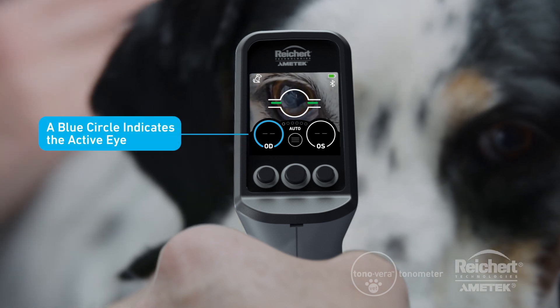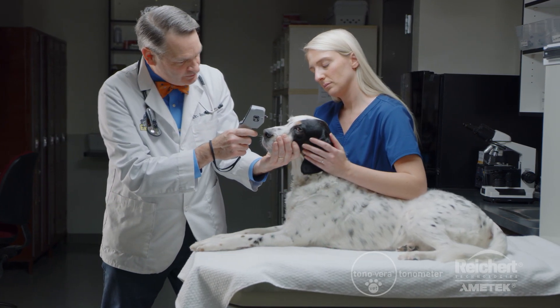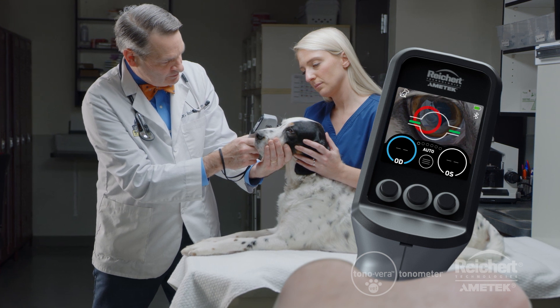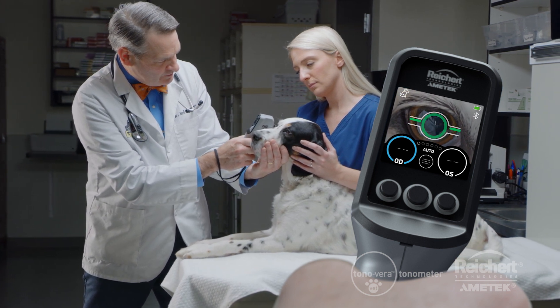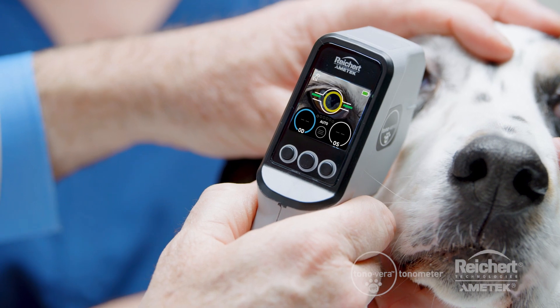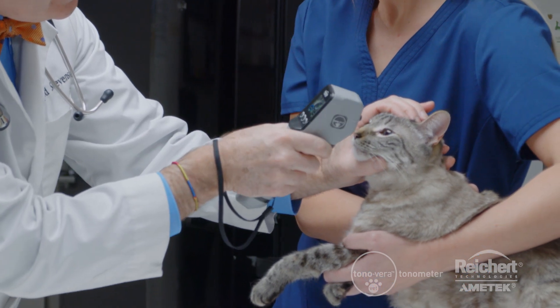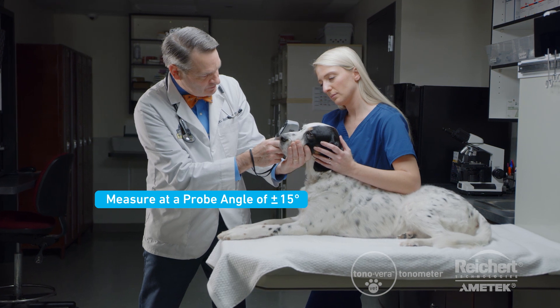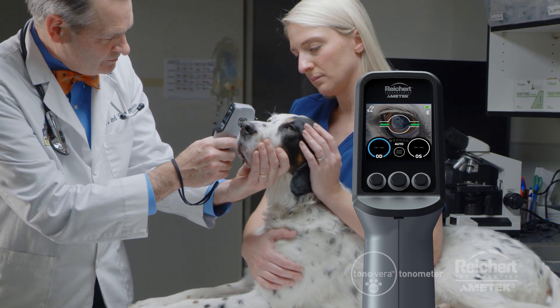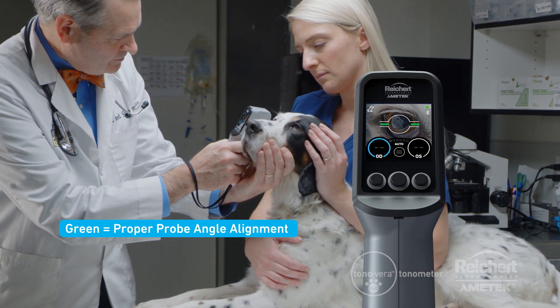The interactive color rings help you achieve proper distance and centration. If the ring is small or yellow, you are too far away, off-center, or both. If the ring is red, you're too close and you'll hear a beep. If the ring is green, you have successfully achieved the proper distance and centration. Once aligned, the Tanavera Vet will automatically take a measurement. You can rotate the device 360 degrees around the AccuDot probe and measure within a probe angle of plus or minus 15 degrees. To ensure the probe is within the required range, there are probe angle indicators on the screen — they will be yellow if the probe angle is too high or too low, and green when the probe angle is within the correct range.